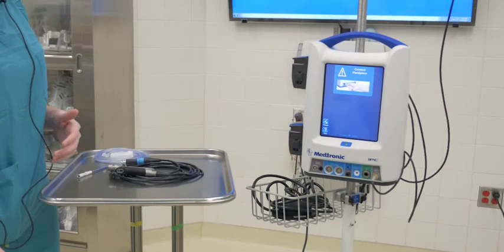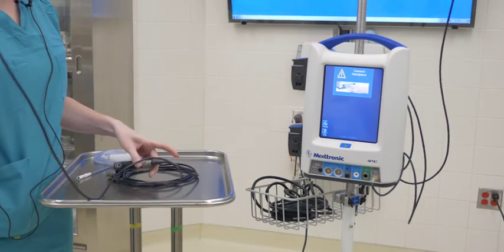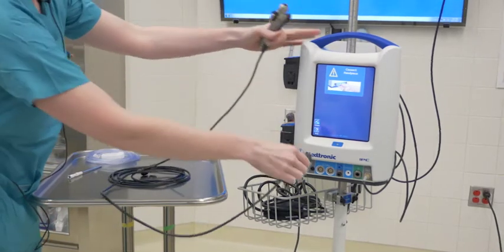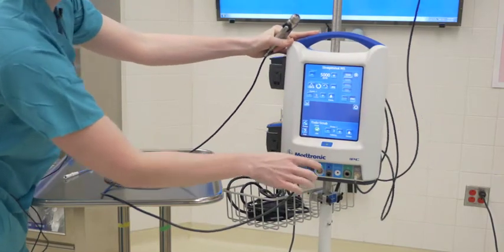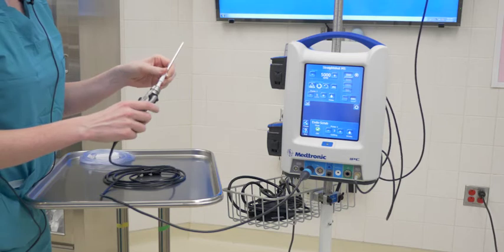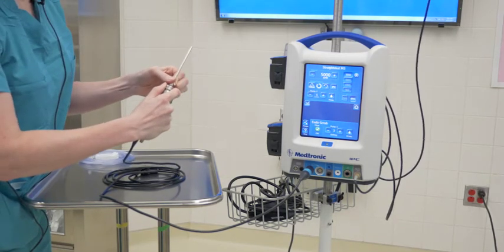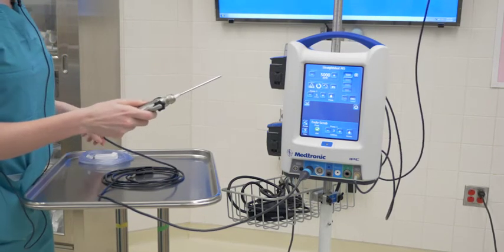Okay, now that we have our supplies, we're ready to plug the handpiece in. So I have the Medtronic straight shot microdebrider. I'm going to plug it into the first port, but it doesn't matter which one you plug it into, the first or second. And then I'm going to load a sinus shaver bit, and you pull back on this collar, push it all the way in, and you'll hear a little click. Give it a little jiggle to make sure it's seated.